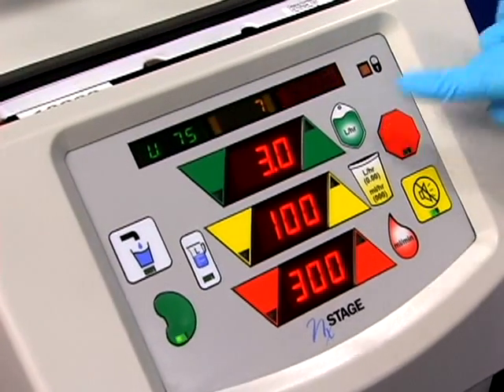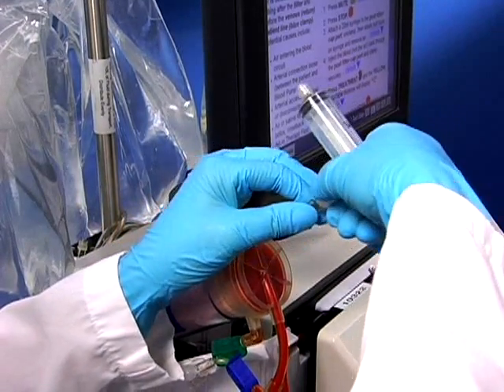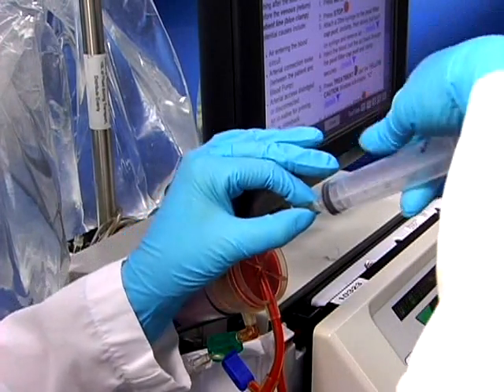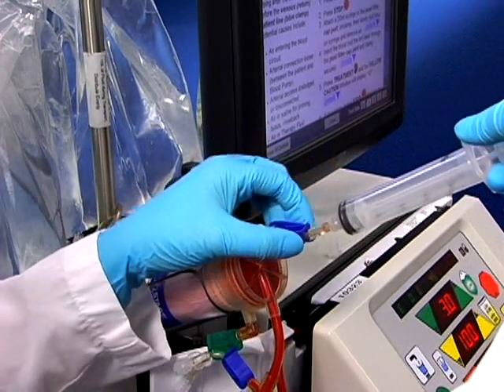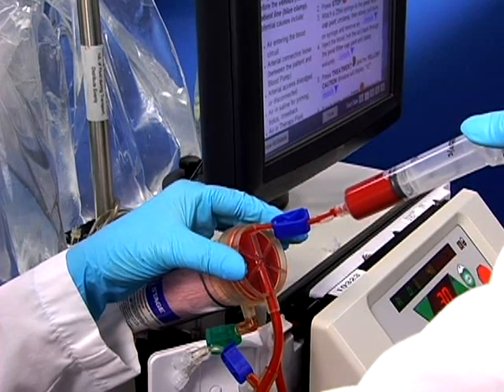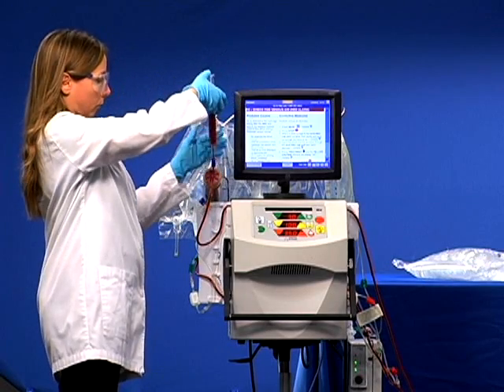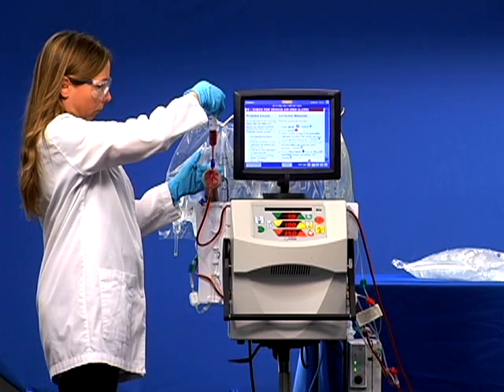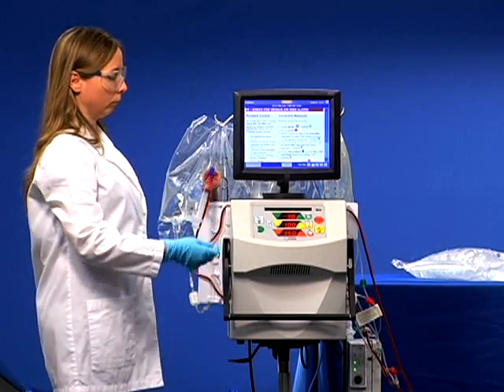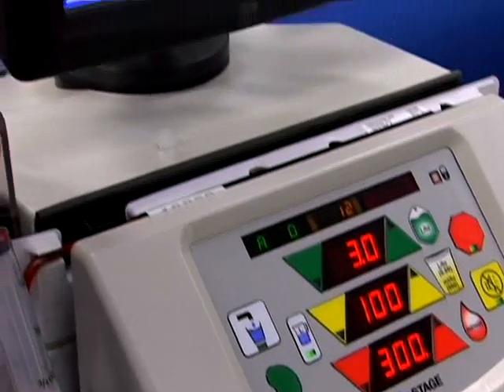Press stop. Remove air from the post filter port by using a 20 cc syringe. Remove the air and return only the blood. Press treatment and the yellow caution window will display 12, air recovery underway.